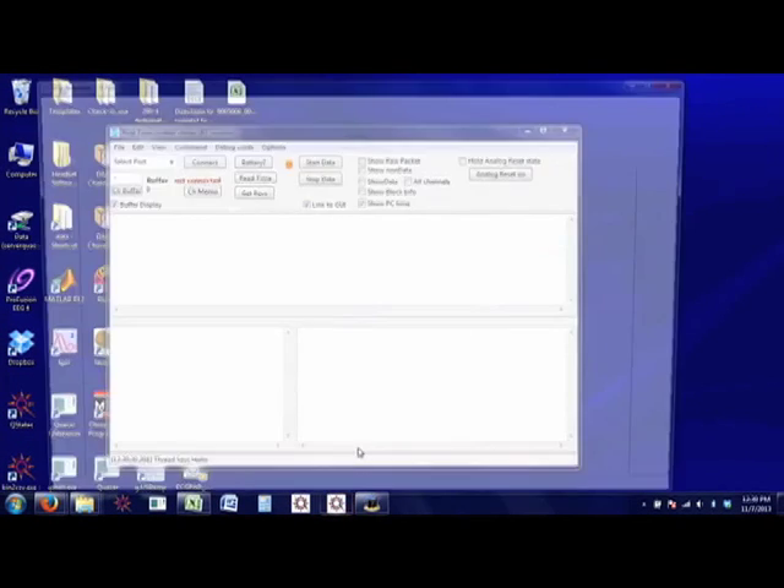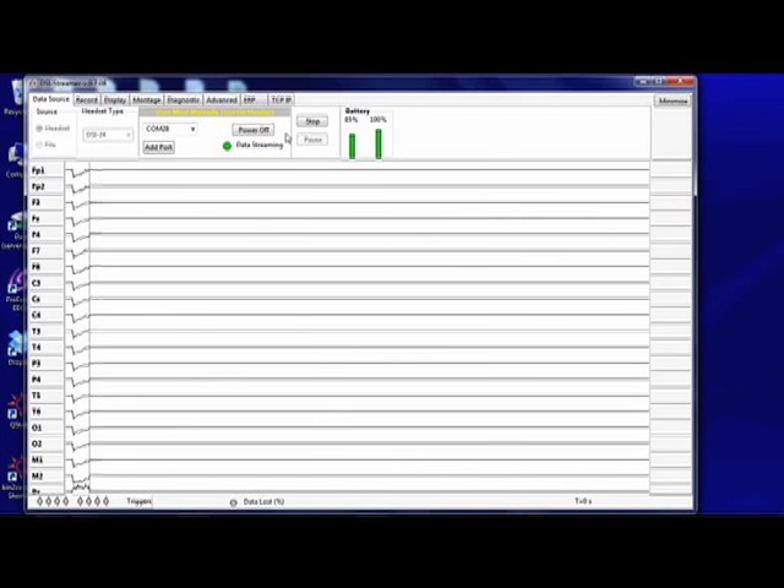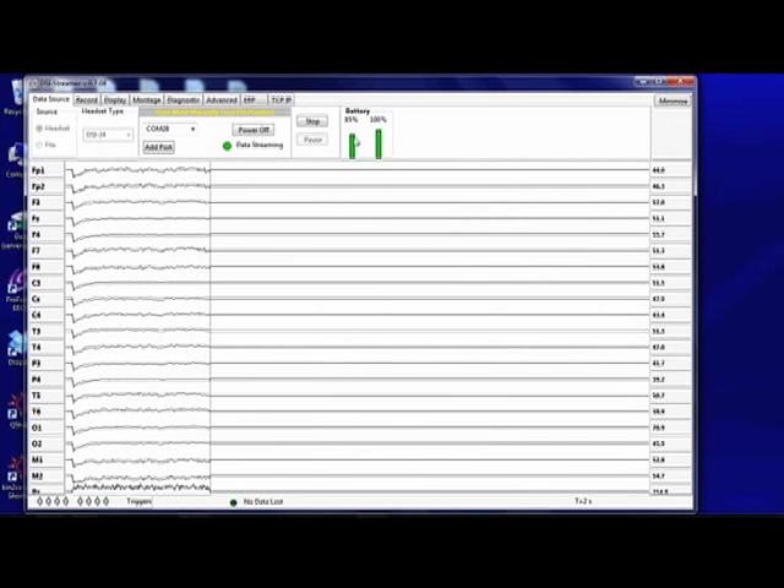Now start the DSi streamer software and select the appropriate COM port number from the pull-down menu and click the Connect button. The system will then connect to the headset, display battery levels, and begin streaming data.